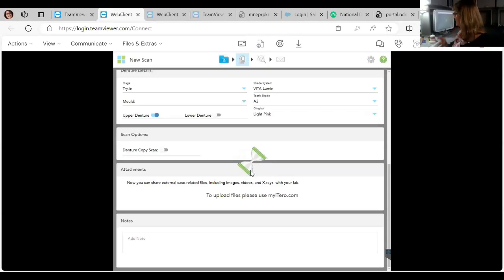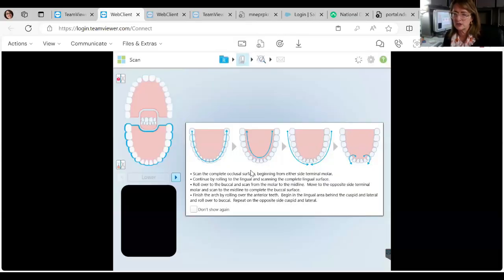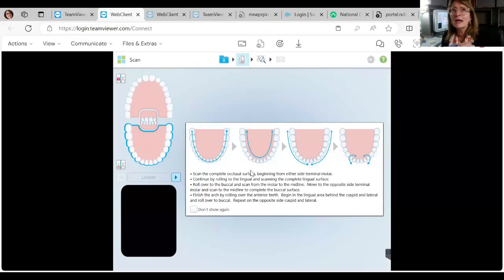I did want to mention one thing: if you do an intraoral scan of the fully edentulous patient and you think you got good data and the lab does not, they think there was an opportunity for improvement or a better way to verify vertical, they may request that they send you a custom base plate with a bite block. That's not a bad thing.